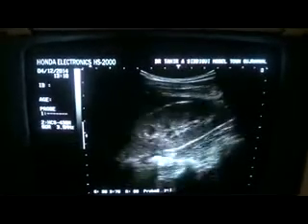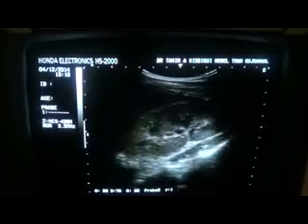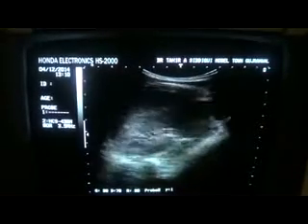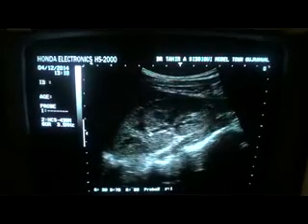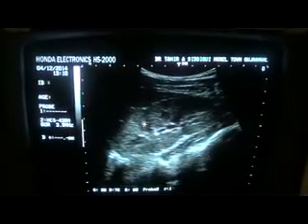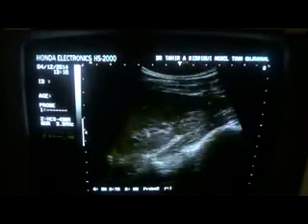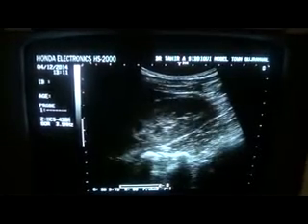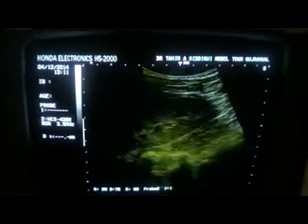In this third, you see how prominent the pyramids are. Normally, you don't see pyramids to be so prominent as we are seeing in this patient. Pyramids are quite significant, prominent. This is the pyramid, this is the pyramid, this is the pyramid. And again now this is the pyramid, this is the pyramid, this is the lower portion.